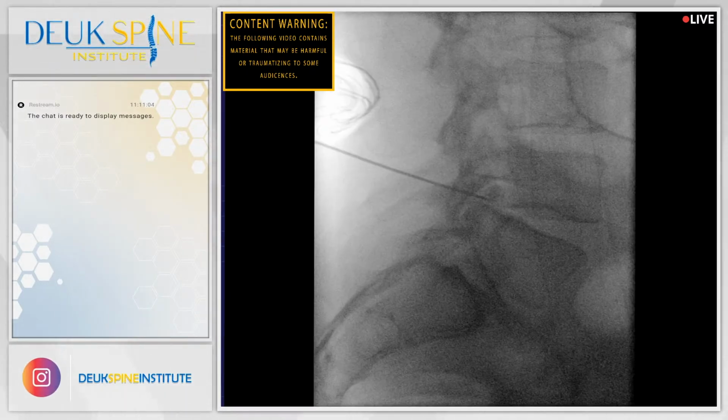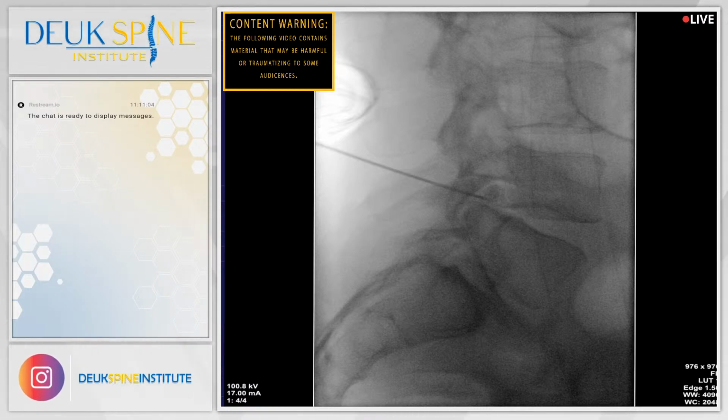So it's very important, folks. We're using an x-ray machine to navigate. All right, do you see? Let me just show you. Do you see the back of the L5 vertebral body, Jordan? That looks like one pedicle and that looks like the other. So I think we're off. And we need to bring that over to there, if that makes sense. So it's a pretty good rotation. He's got really bad scoliosis, folks, right at L4-5.